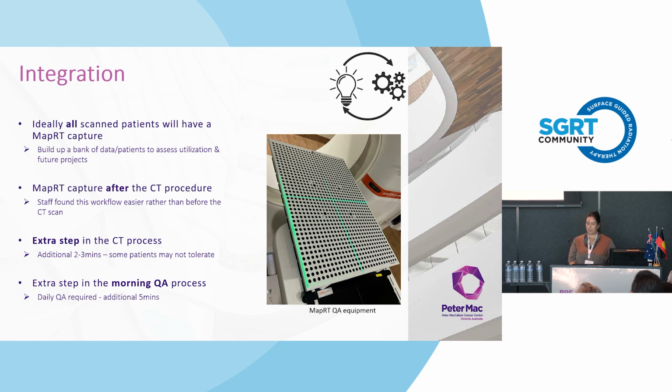We also found that the MapRT capture was easiest for staff to actually take after the CT scan procedure itself rather than before. Although the MapRT capture process is relatively easy, the capture is still adding an additional step to the overall CT process. It does add about 2 to 3 minutes of additional time that the patient must remain still in the overall appointment, which for some patients obviously isn't an issue, but for others might be problematic depending on their performance status. So taking a MapRT capture of all patients might not always be possible.